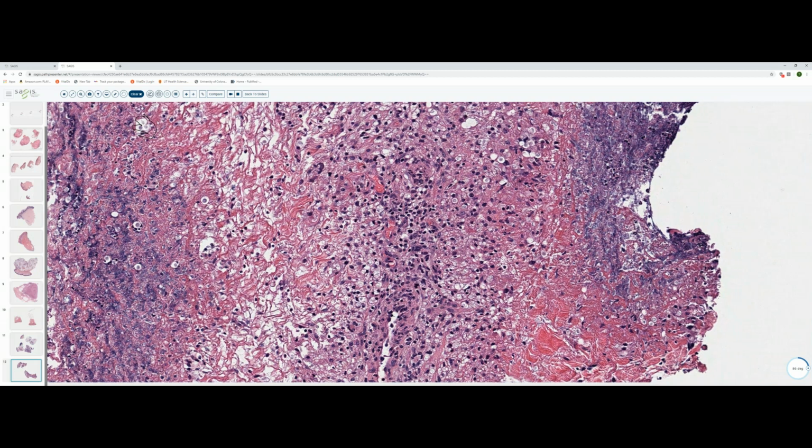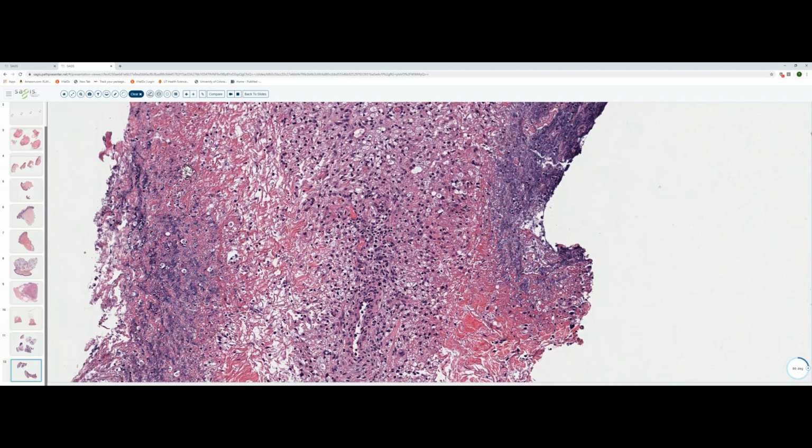Some are small, some of them, like this one that is circled up at the top, have really narrow-based buds, and most of them are surrounded by a clear space. And in some of the clear spaces, you almost have little yeast condos forming. And this is an example of Cryptococcosis.